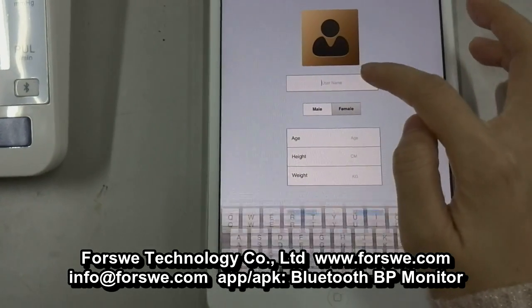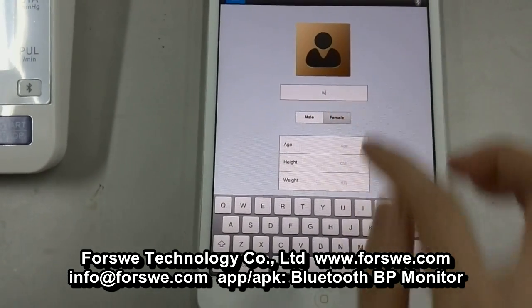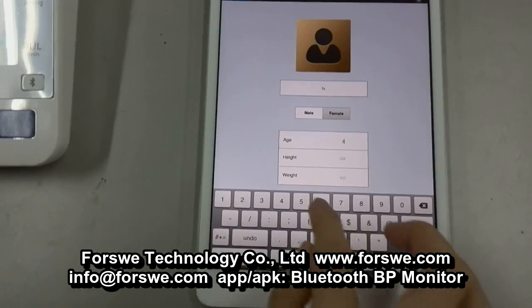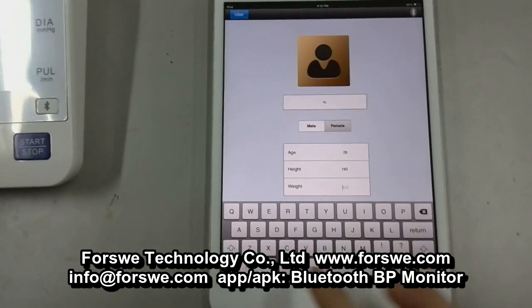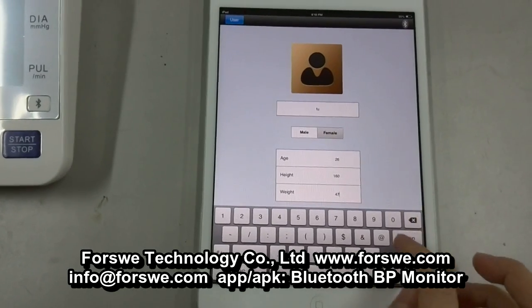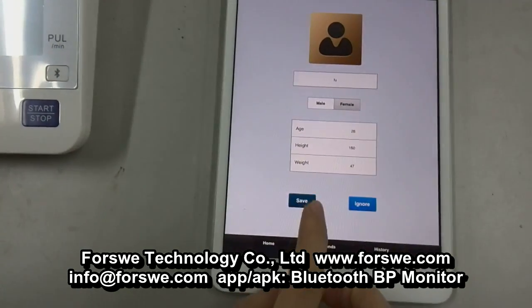Input your name, choose your sex, then the age, the height, the weight. Then press the Create button and save.